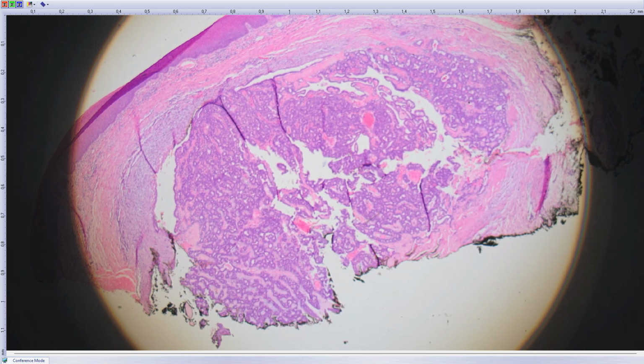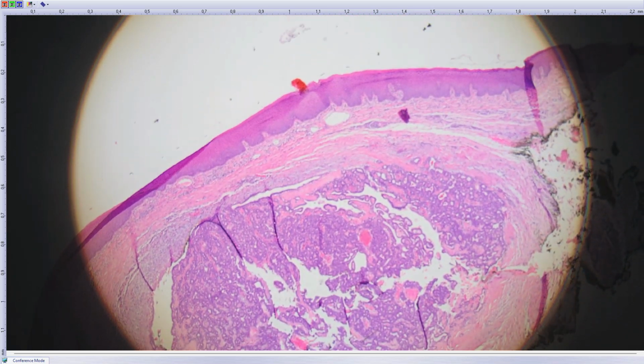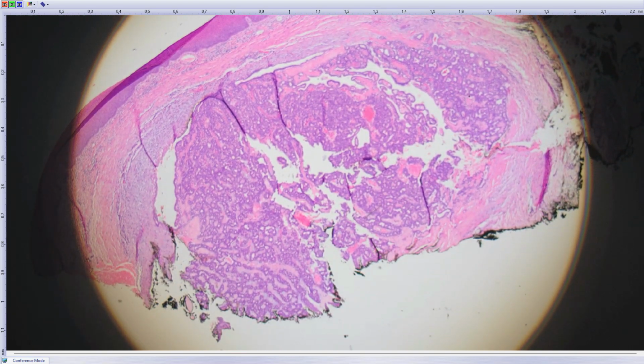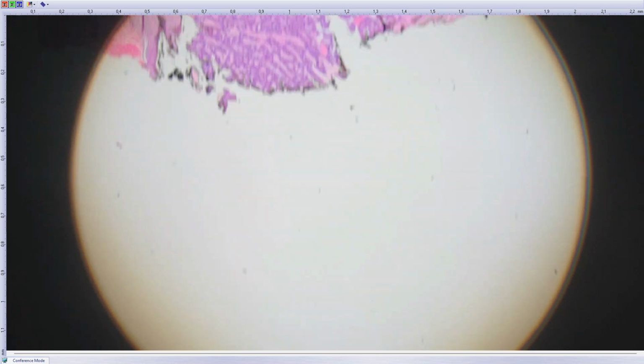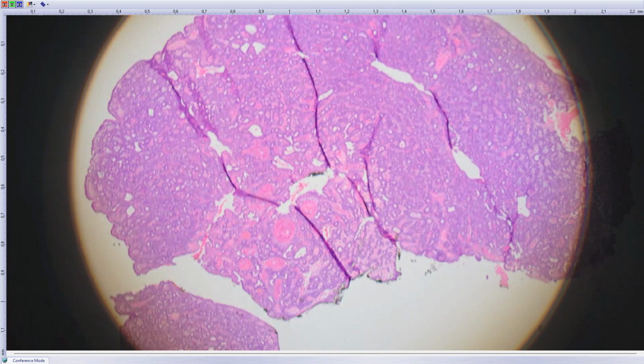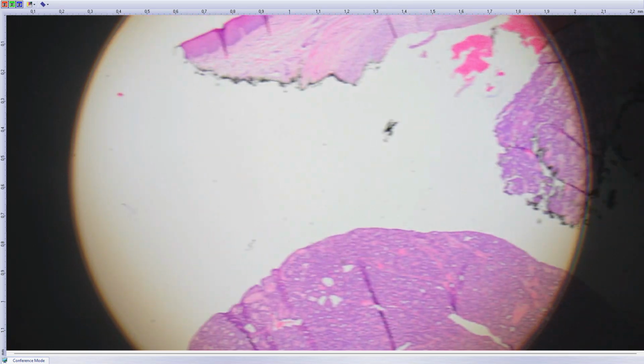The first one is a probatory excision of a lesion which was located in the palate of a 73-year-old female patient. And we can see squamous parakeratinizing epithelium of the oral mucosa and some kind of tumor, which I will show first in scanning magnification to show you the general structure.